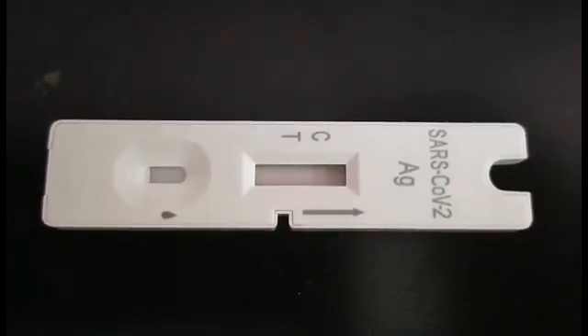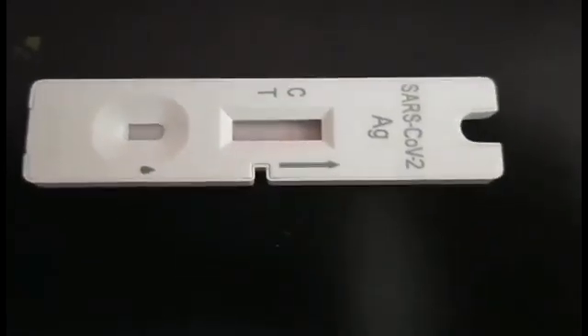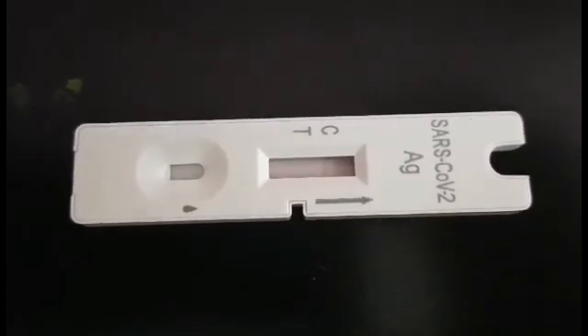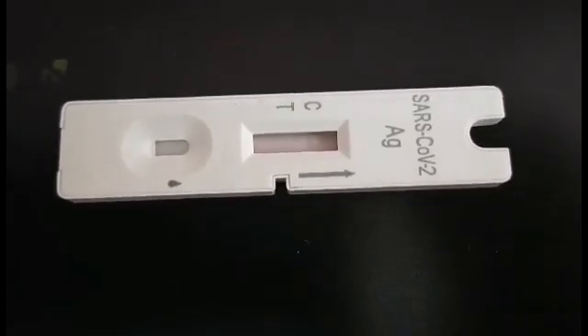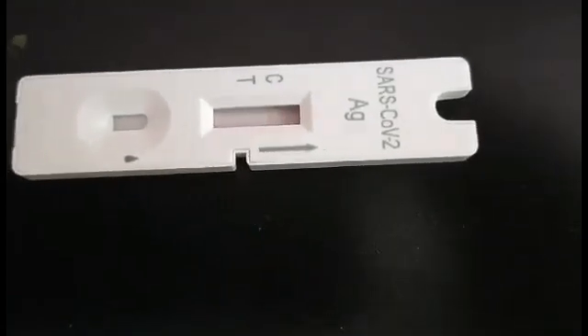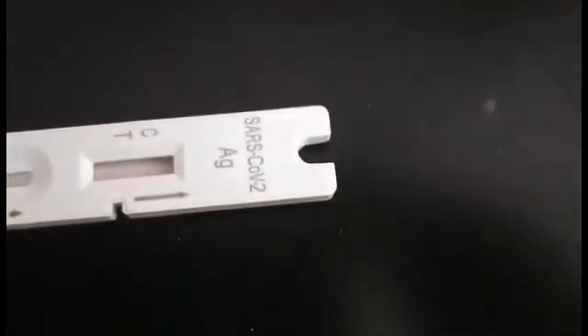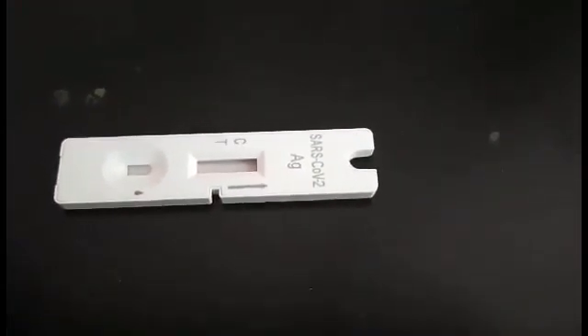One line. Ano ba naman to? So, negative. Hindi naman kasi ako nalabas — paano naman ako magpa-positive, no? Okay guys, so ayun. Done. Negative. Parang pitik lang.